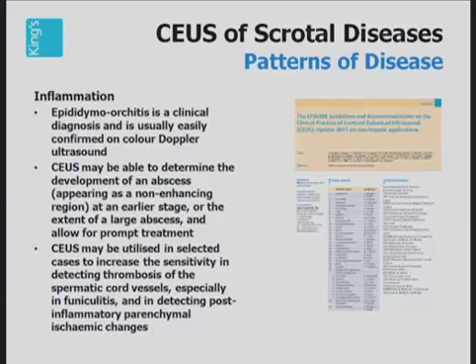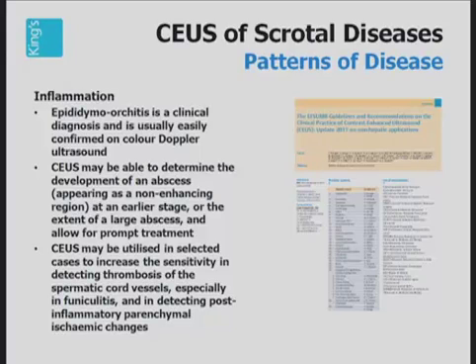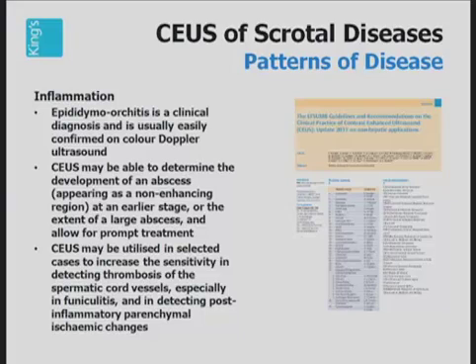Let's move on now to inflammation. Epididymitis is usually a clinical diagnosis and is usually easily confirmed on color Doppler ultrasound. The addition of contrast-enhanced ultrasound will allow you to determine whether or not an abscess is appearing. This is a non-vascularized area and will not enhance. If you can detect an abscess at an early stage or delineate the extent of a large abscess, this will allow prompt treatment.